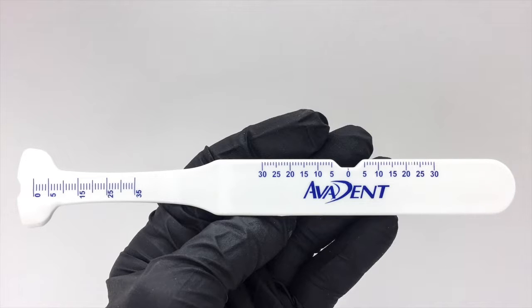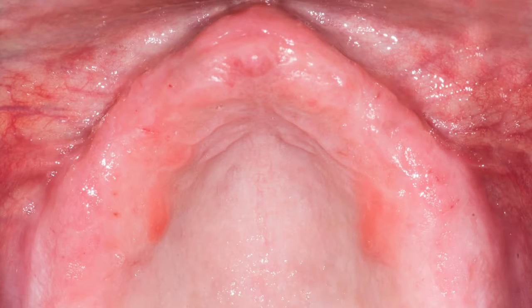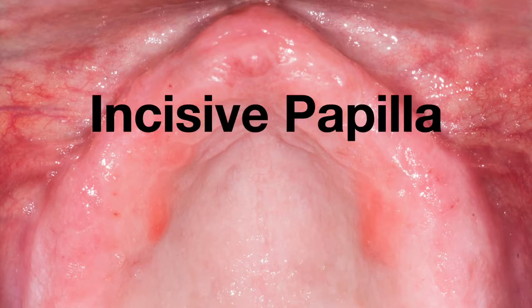Next, you will make and record 2 facial and 2 intraoral measurements that will be used by AvaDent to design your WTI. You'll make these measurements using a device we call an Avameter, a device specifically designed for this purpose. The first and most important measurement in the protocol is the IP, or incisive papilla measurement.